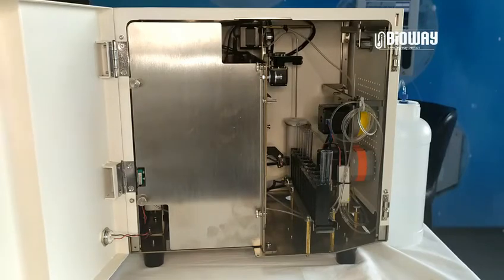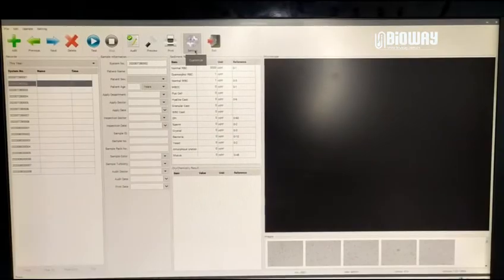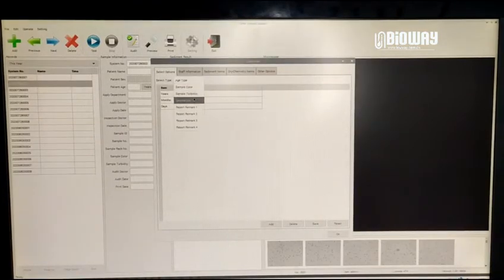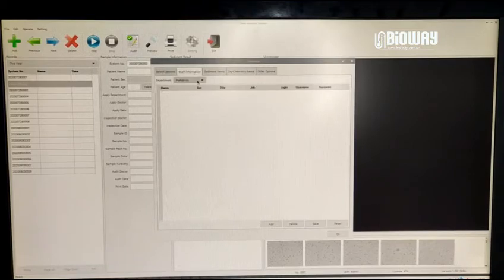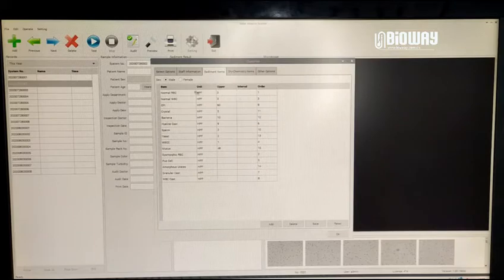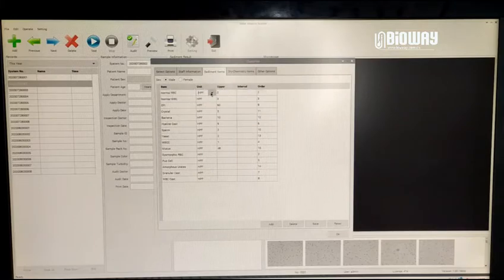Now I will show you the system settings. Let's get into settings. In the selection options bar, there are report options. In staff information, you can add the name of department and staff. The third one is sediment items — you can add the unit, upper value, and order of each item.